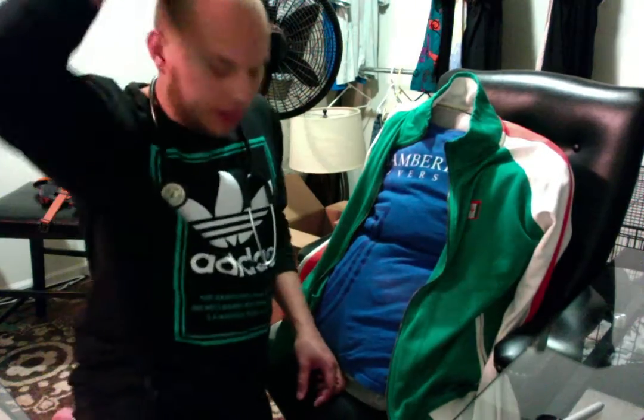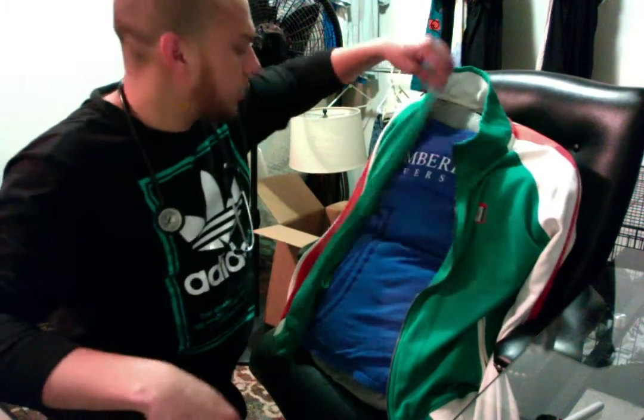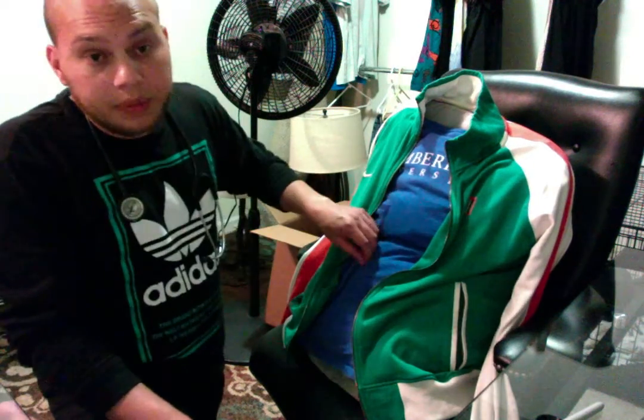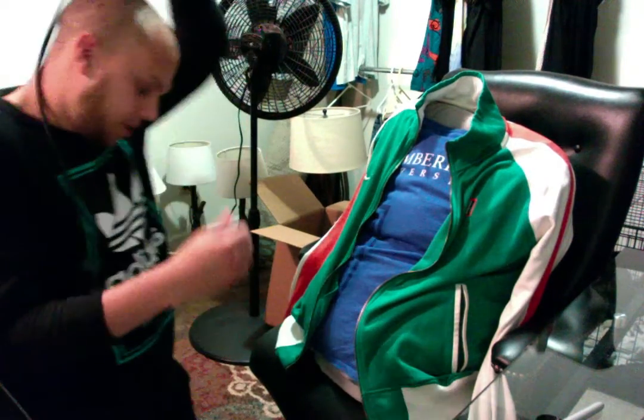Okay, all right. The next part of the assessment, sir, is going to be your respiratory system. So if you could take your shirt off for me, which you would be doing at this point, so that I can put my stethoscope directly up to his skin. I'm just going to listen to a few sounds on you, sir, okay?